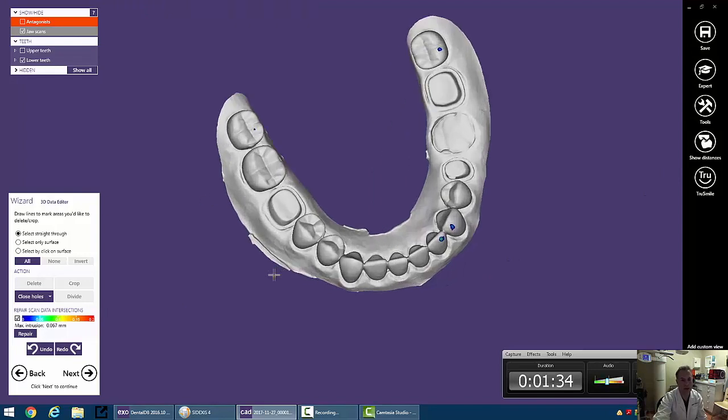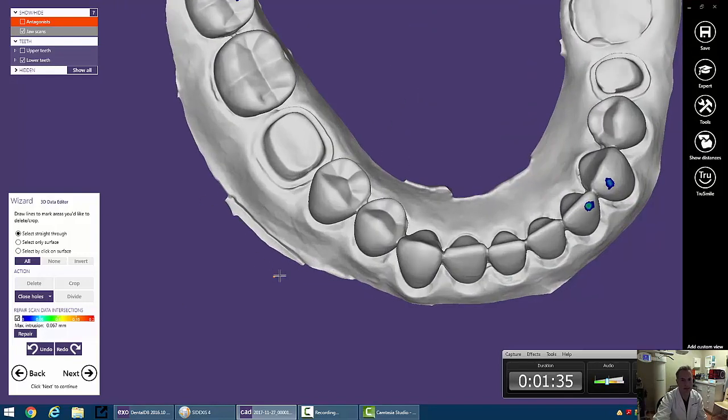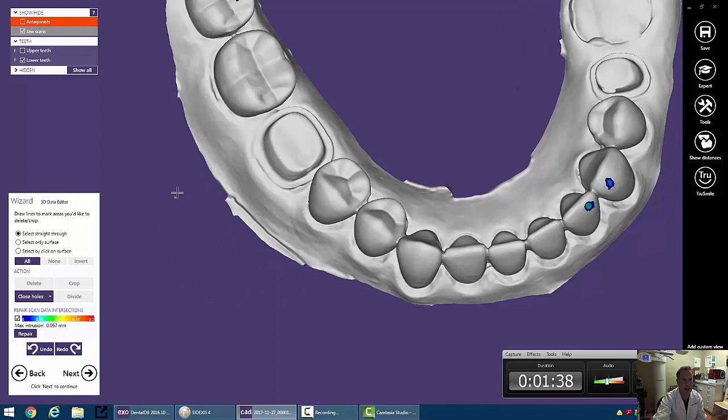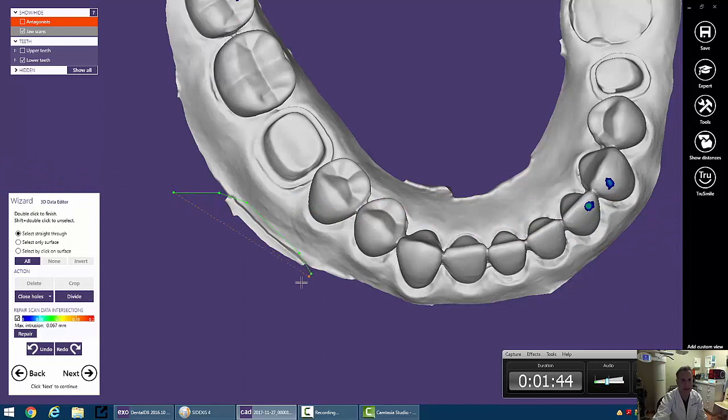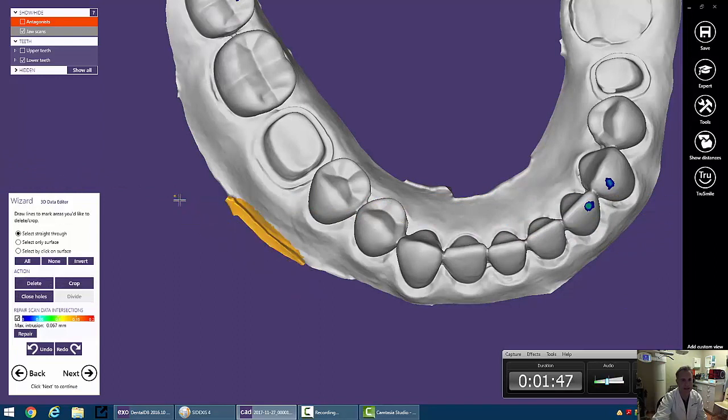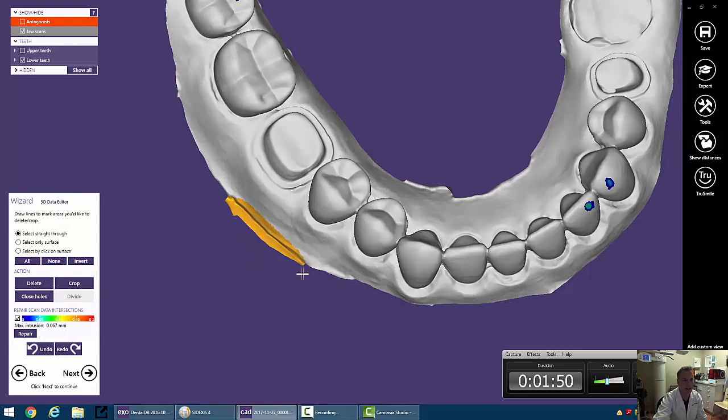So over here, we've got a little bit of flash on the side, and so we want to go ahead and cut that off. So we just single-click with the left mouse button, and we can come around here and double-click at the end. The area that is selected is highlighted orange.